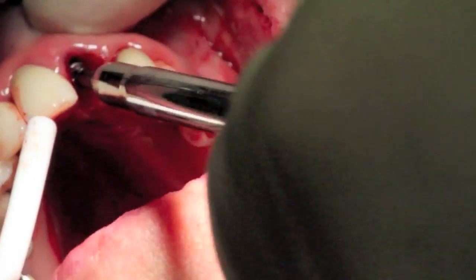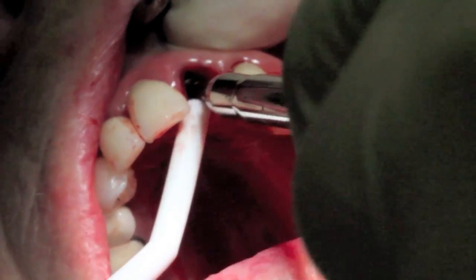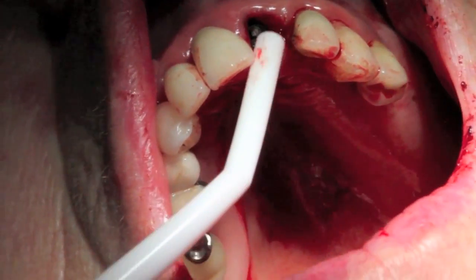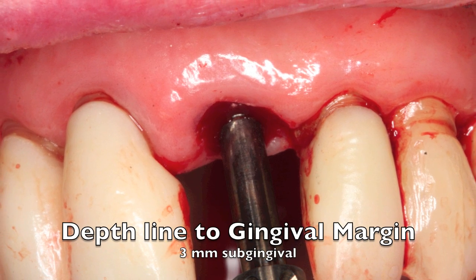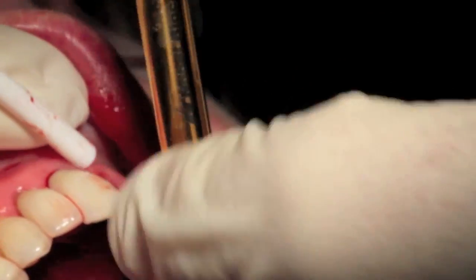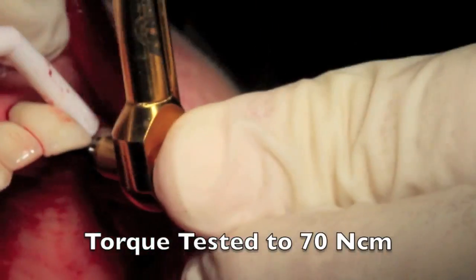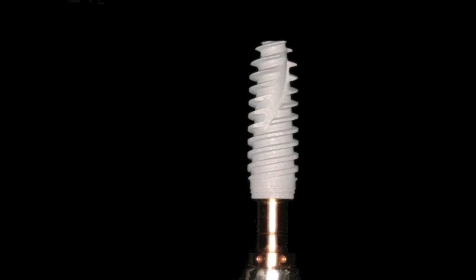When you're preparing the bone for this type of procedure, you need to actually under-prepare a little bit, because only about 3mm or more of the implant is going to be in bone on the palatal wall. So we do have to have that ability to get that implant up to about 70 newtons. We want to definitely be at about 35 newtons to do this procedure, or you have to abort. If you abort the procedure, you'd put on a healing abutment flared to 5mm to help seal the socket, but also to preserve the papilla.